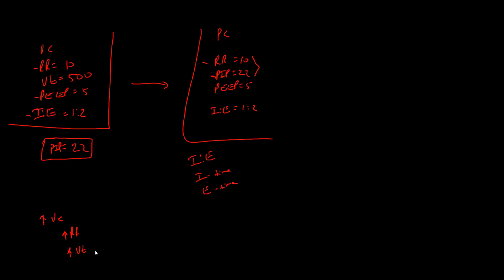Okay. So sometimes it's personal preference. Some physicians like pressure control better than volume control, and vice versa. But pressure control, and this will be really important on your test, is for when you need to get into a lung protective strategy, meaning here we have a patient and they are turning into an ARDS type patient. Okay, with ARDS, you have very low compliance. Their lungs get really stiff.